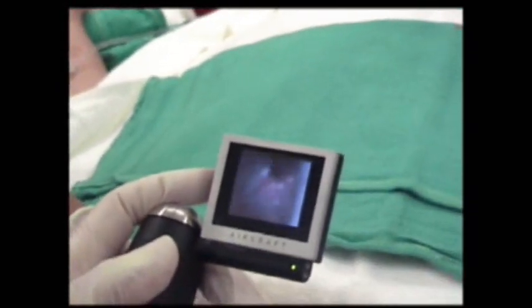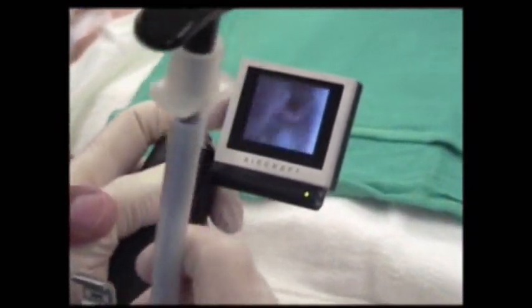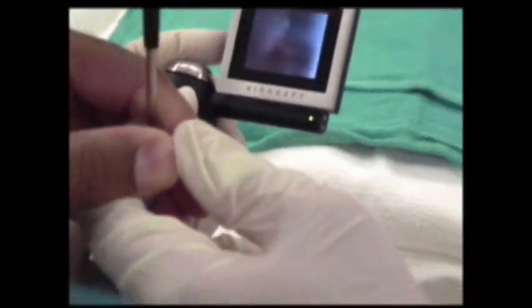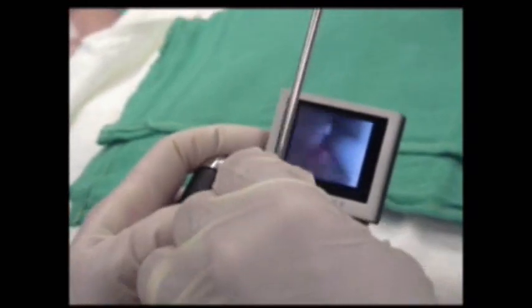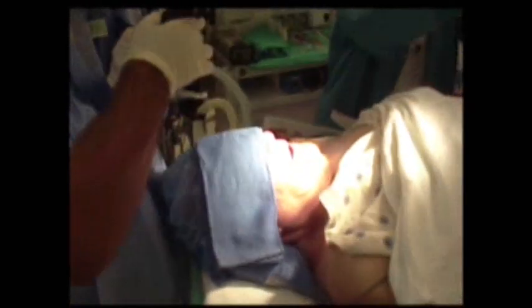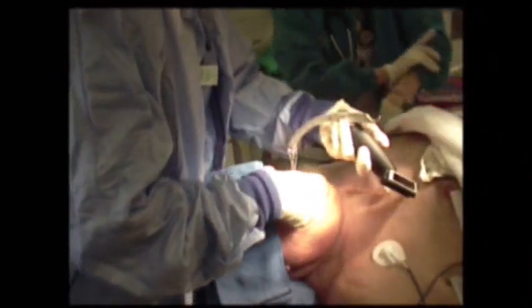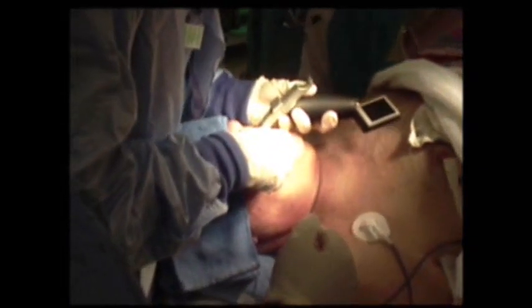Come back with the blade just a little bit. There you go. There we go. The advantage is that you get a much better view under conditions that would otherwise prove difficult for laryngoscopy. The position of the camera is very close to the glottis, and you don't have to line up the oropharyngeal and laryngeal axes the way you do traditionally, so you can intubate in the neutral position.